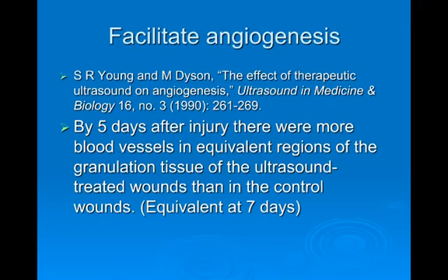And so kind of the thought here is, and again, here's where we have some of the animal models that show pretty good support. These guys, Young and Dyson, looked at the effect of ultrasound on angiogenesis in rats, and they found that they had a lot more blood vessels after 5 days, but things got to be pretty much equivalent by 7 days.